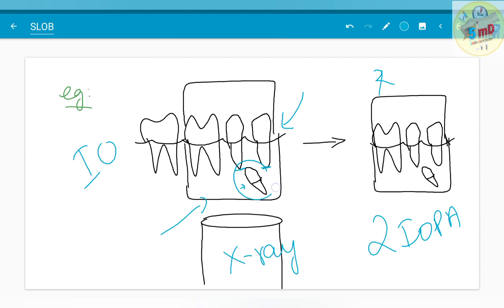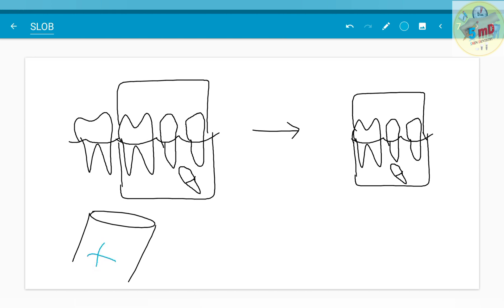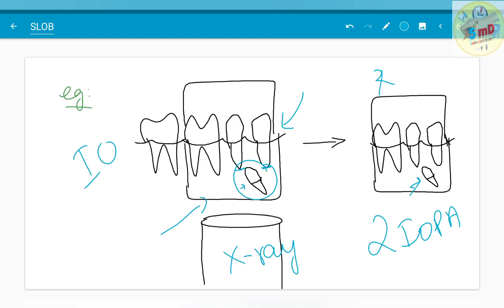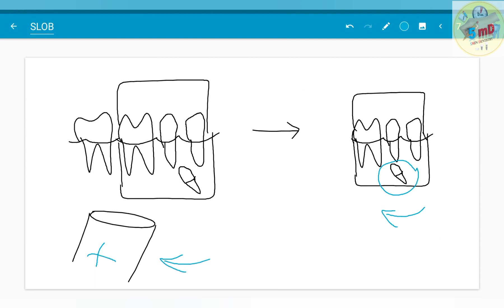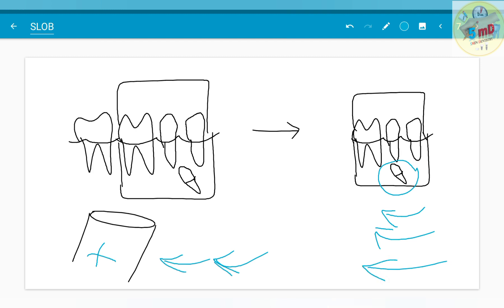The object of question here is the supernumerary premolar. The first IOPA shows the position of the supernumerary impacted tooth. The second IOPA is taken with the x-ray tube shifted either distally or mesially. Here, the tube is shifted distally, and the result shows the object has also moved distally compared to the first image. Since the tube shifted distally and the impacted object also shifted distally, this is a same-side shift — indicating the object is lingually placed.